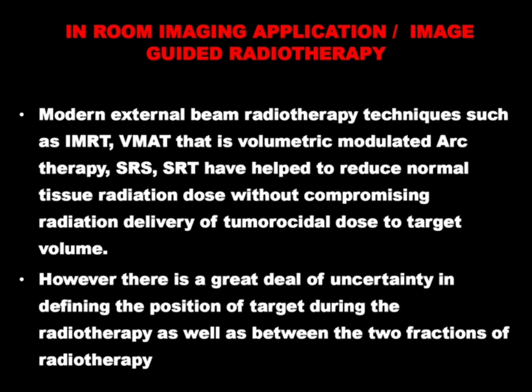Why? Because CT is the baseline. CT provides the electron density, which correlates perfectly with soft tissue density, so the dose calculation becomes very easy. That's why CT is the baseline for any form of radiotherapy planning till date.